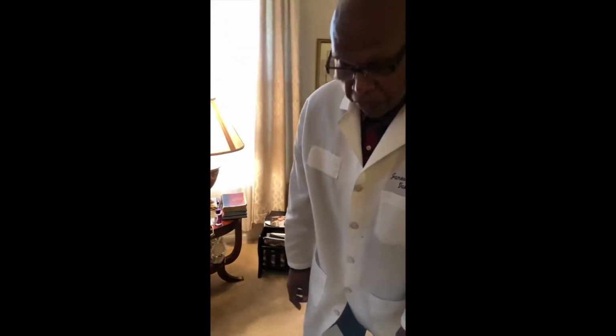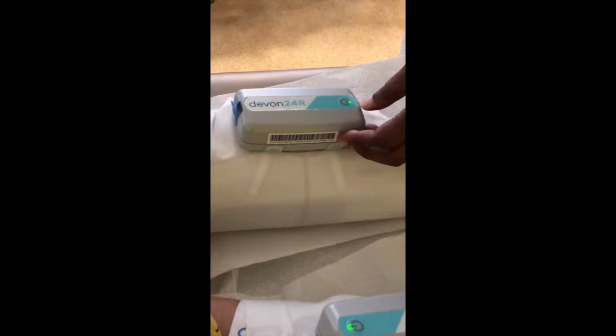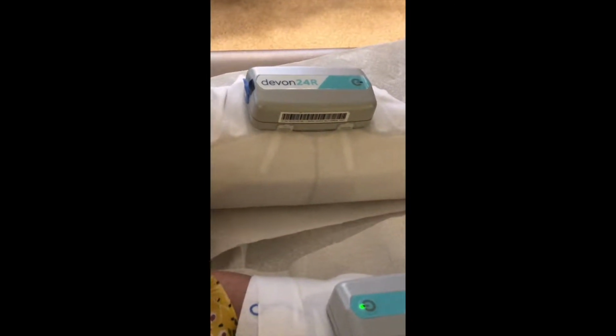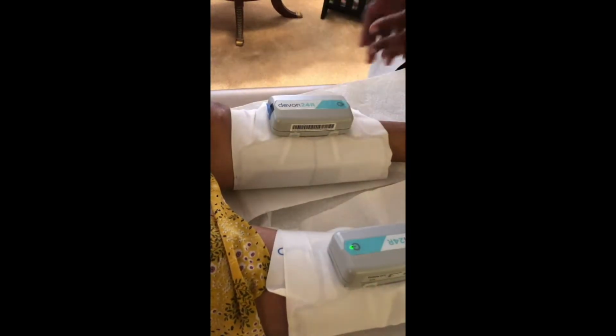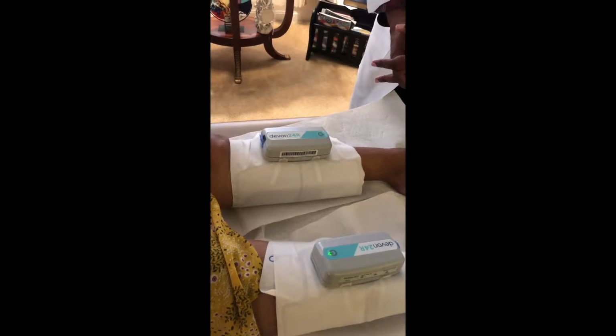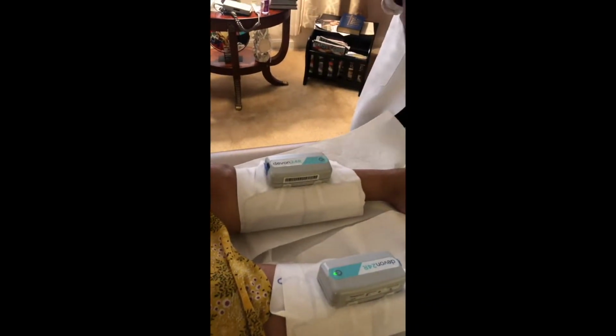There are a lot of individuals who suffer with DVT, which is deep vein thrombosis. And this is a gadget that helps with the edema in their legs. Just hit the button here, and then press it again, and it inflates. What that inflation is doing is compressing that fluid and forcing that blood up the leg so it won't stagnate and start to coagulate and develop a thrombus. So it presses, then eventually it'll release, and it does that every few seconds. Individuals who have edema, or who have had previous DVTs, this is an excellent piece of equipment to stimulate that circulation so you won't have the DVT occur again.